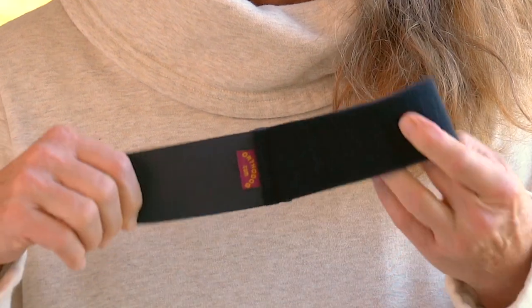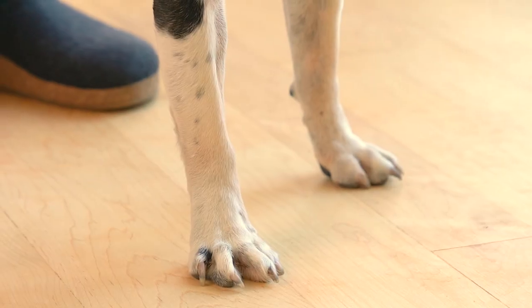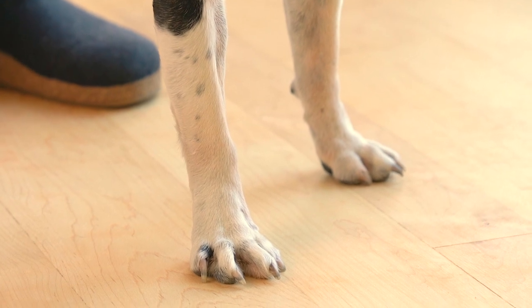The OrthoDog Wrist Wrap Brace is designed to stabilize your dog's forearm bones and to lend support to the muscles and tendons of the wrist and front leg.